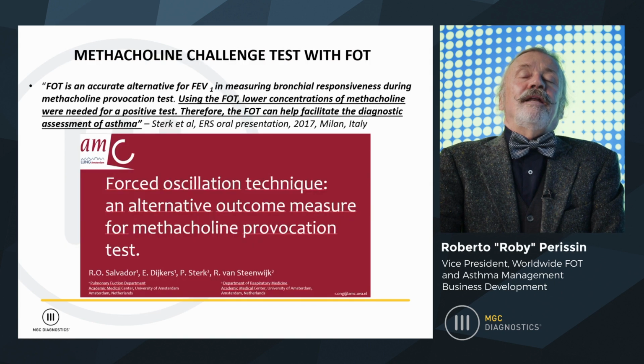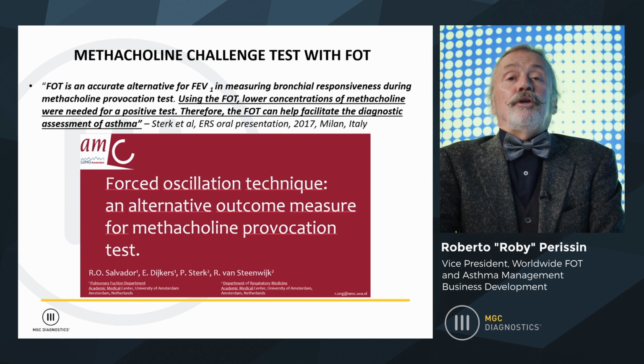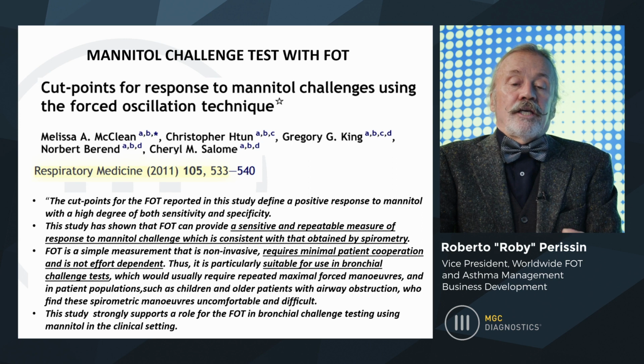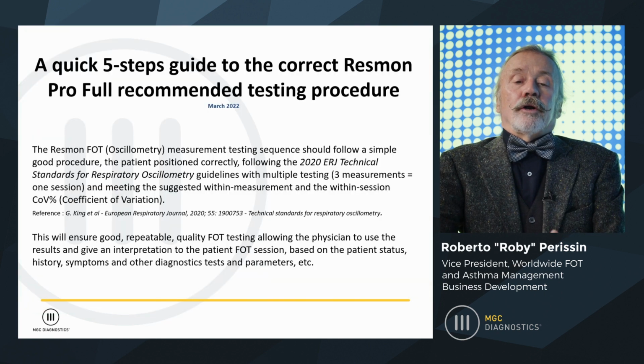Obviously, there are many papers and validations showing that FOT can really help facilitate the diagnostic assessment of asthma, and it can be used with different agents, including mannitol testing, where FOT was very helpful and suitable for use in bronchial challenge. Let's now go to running a measurement, starting from the patient posture.